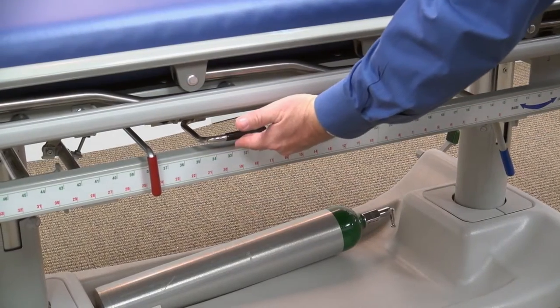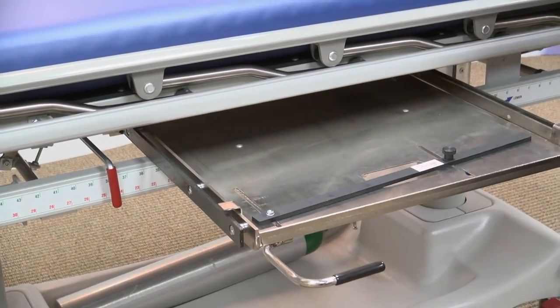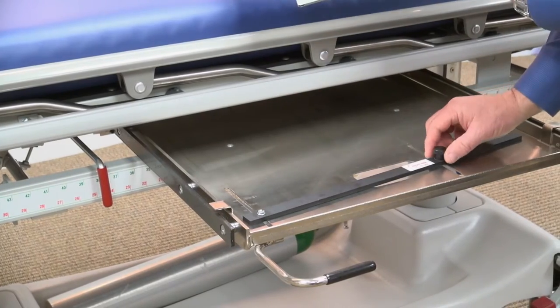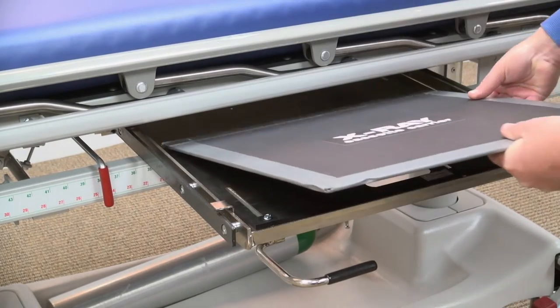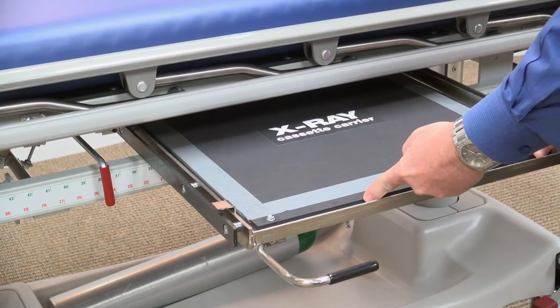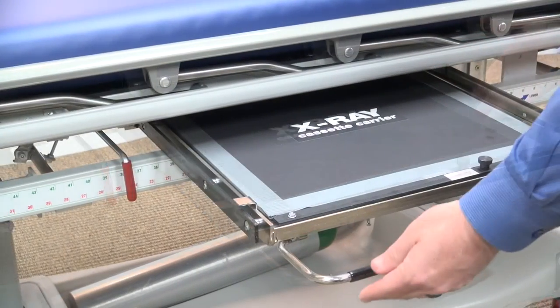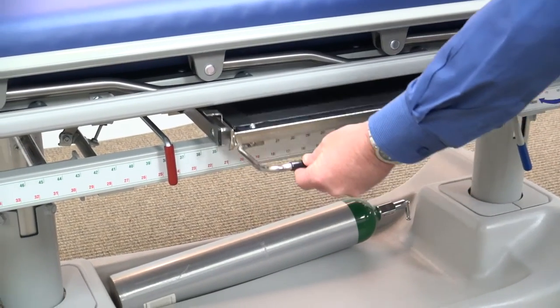A full-length tracking X-Ray cassette carrier, which can be accessed on either side of the stretcher, provides ultimate imaging flexibility from head to toe. Its design allows you to easily insert the X-Ray cassette and secure it in place with just a turn of the knob. A convenient black lever is there to slide the carrier under the stretcher.